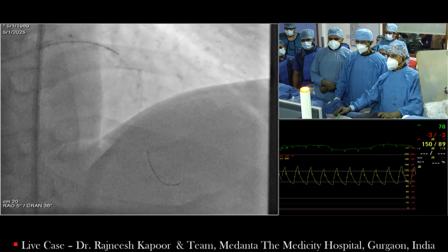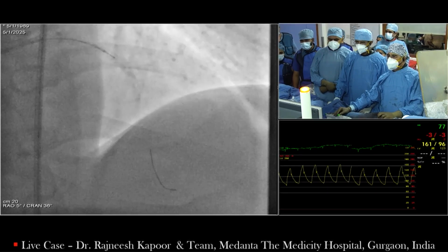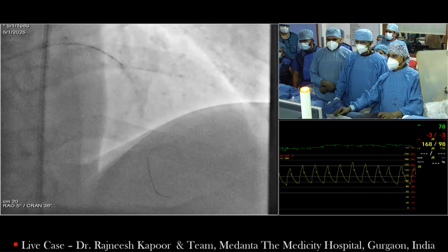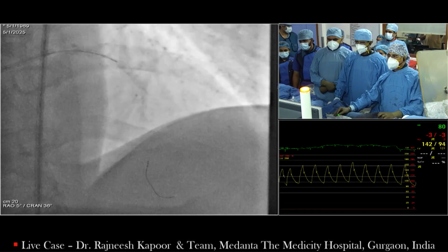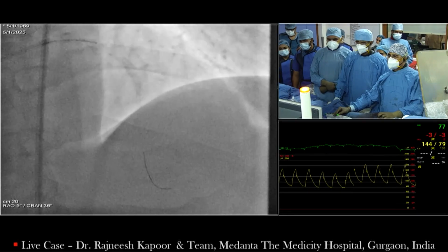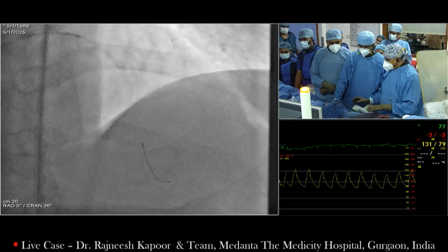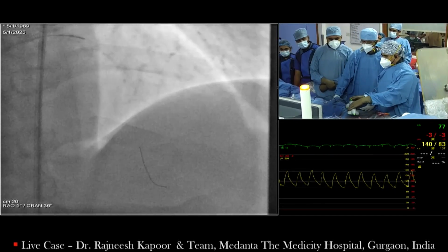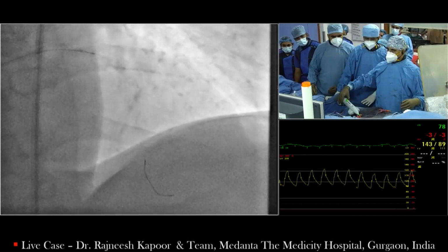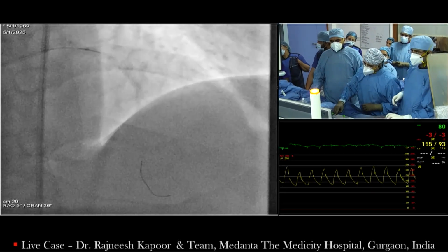Can you hear the sound? I'm not sure whether this sound is audible. There's a lot of grating sound while we do the orbital. It's very important, CSI. Yeah, with orbital, you do not want to increase to a high speed to get through, because that's where you have the most perforations. You need to stay at low speed and be patient.